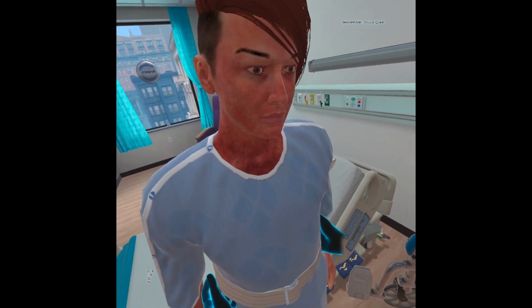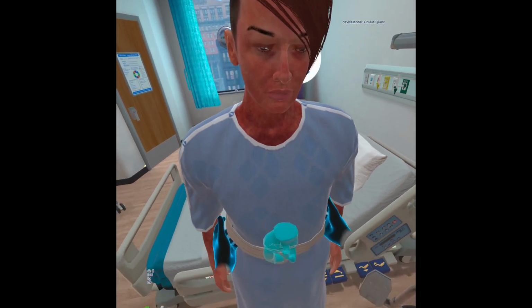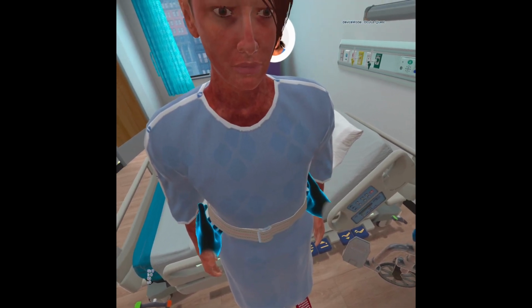Keep holding the gait belt while Riley finds his balance. Use one hand to check if we need to tighten the gait belt now that he's standing. Place your fingers under the belt. The belt still fits snugly. Grasp the gait belt again.